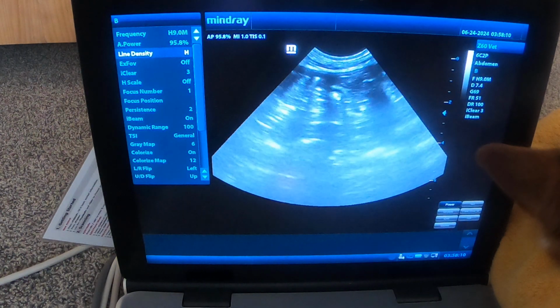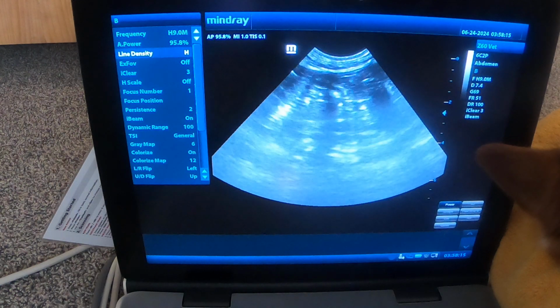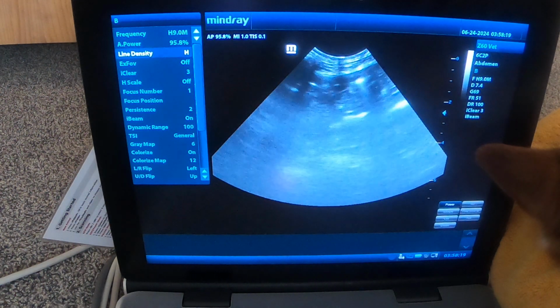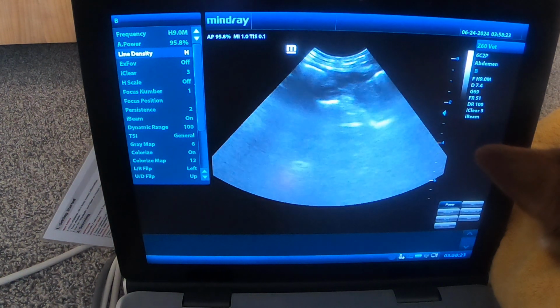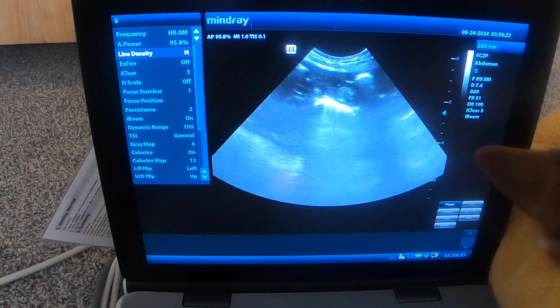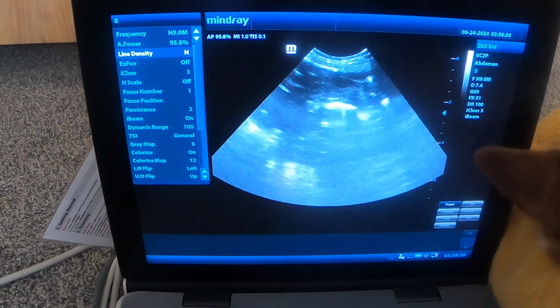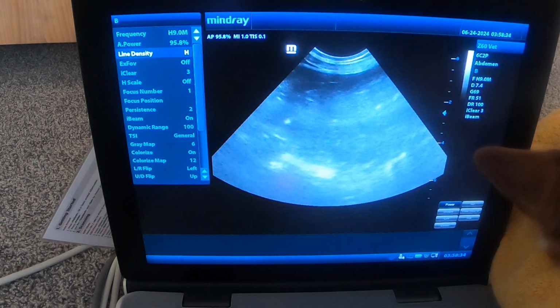All right, so that is an abdominal FAST scan. Great thing for everybody to do. I've seen clinicians even asking their technicians these days to do a quick FAST scan. So maybe if you're working in the ER, it might even become part of your initial diagnostics. So, hey, can I get a TPR, blood pressure, PCV, total solids, lytes, and a FAST scan? And we can do that really fast too.